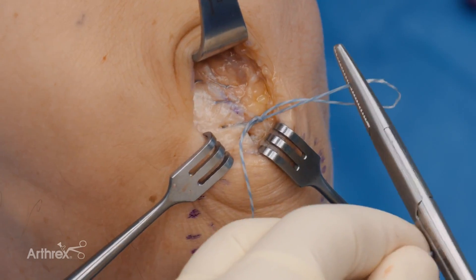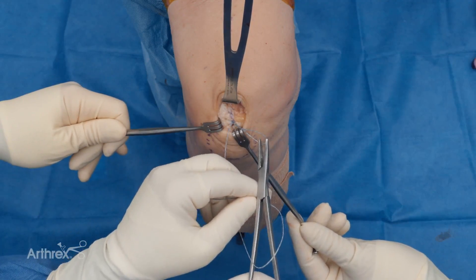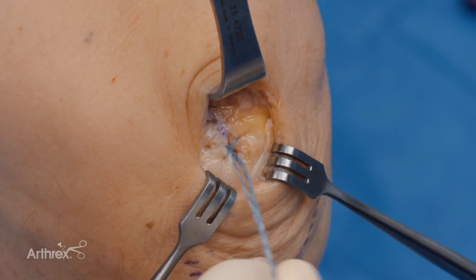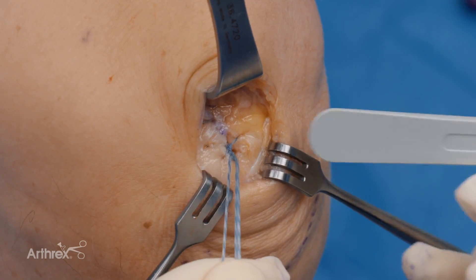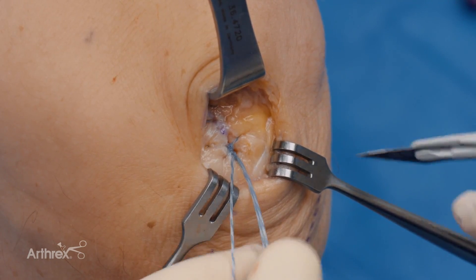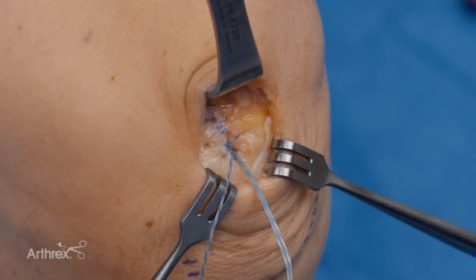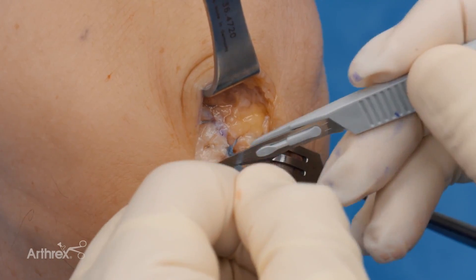Once you're satisfied that you've got it maximally tight, you're just going to put the half hitches on top. At this point, I typically just cut it. If you're worried about it — I've never had a patient complain of any prominence of the knot; they don't feel it — but if you wanted to, you could certainly cut off two of the limbs, do a free suture and bury the knot in the quadriceps tendon. I generally just cut it, and that's been very effective in my practice.